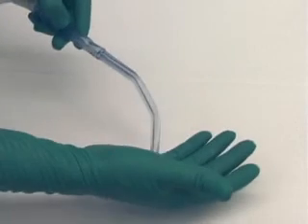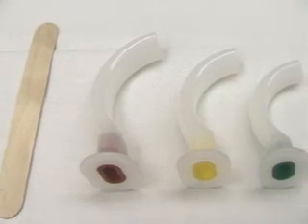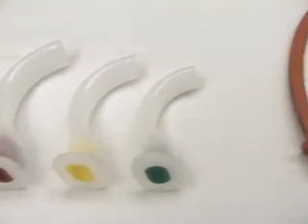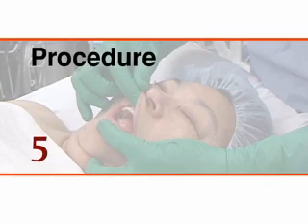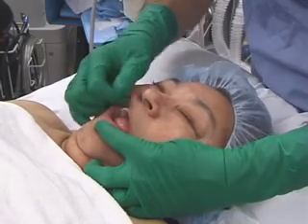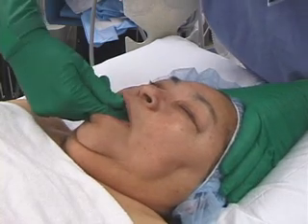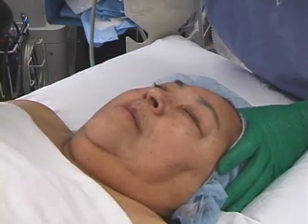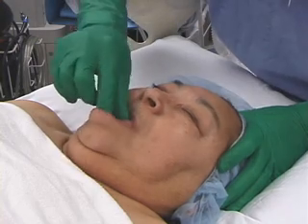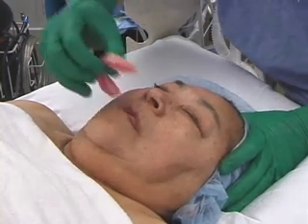Whenever possible during face mask ventilation, suction should be readily available. Airway management adjuncts such as oral or nasal airways may need to be used. Before beginning face mask ventilation, it is prudent to examine the patient's oral cavity when possible. Smaller dental prostheses or other foreign bodies can be swallowed or aspirated. One may consider leaving full dentures in place to provide a better mask seal.